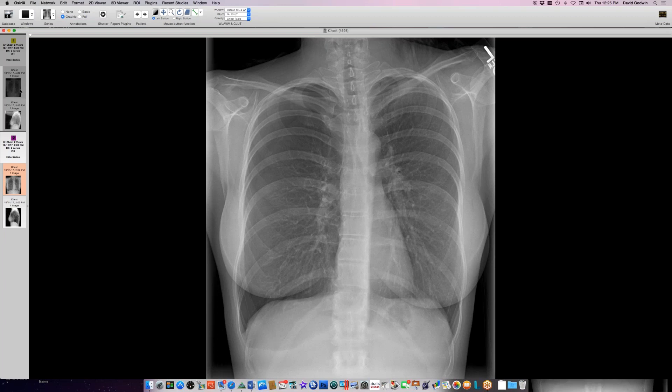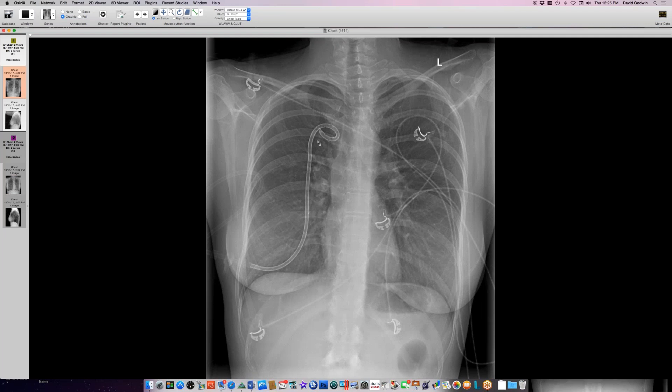She was treated with tube thoracostomy. The pneumothorax got better and she went home a couple of days later. This is an acupuncture-induced pneumothorax — there are case reports of such things. The needles are supposed to be superficial, but if they go too deep, and she's a slender person, there's not all that much space between the skin surface and the pleural space.